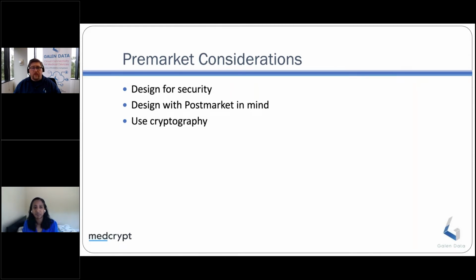Yeah, absolutely. Just making sure that you're considering that in every aspect of your design. As was alluded to, UI and UX are just as critical for this as the actual software running within the firmware in the device.